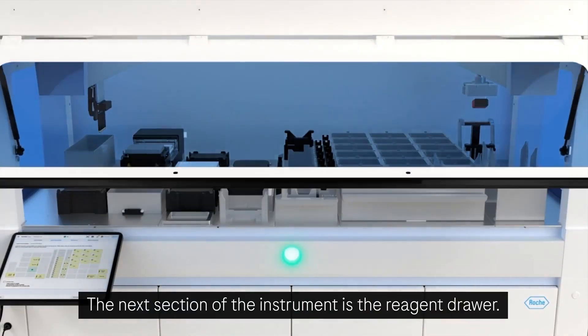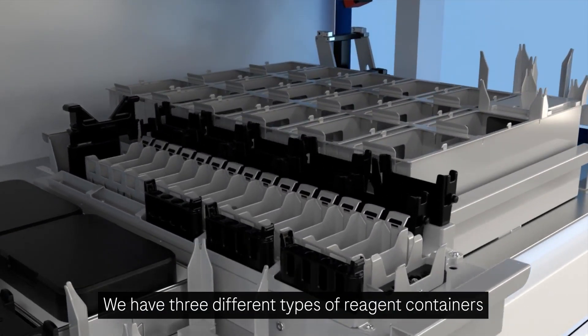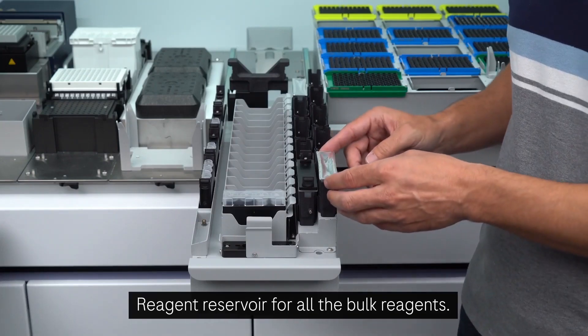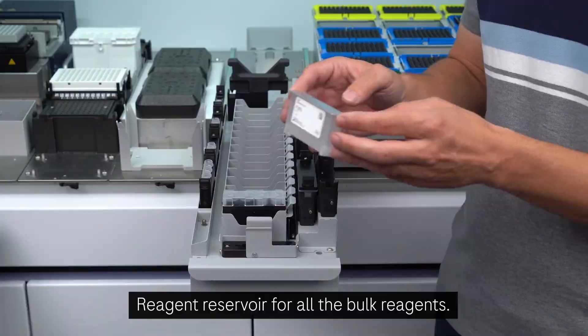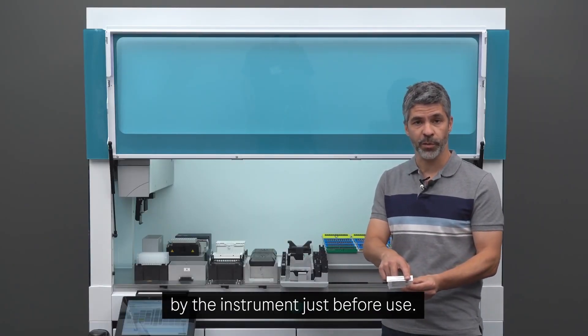The next section of the instrument is the reagent drawer. We have three different types of reagent container needed to perform the workflow. Reagent reservoir for all the bulk reagents. They come pre-sealed and will be pierced by the instrument just before use.